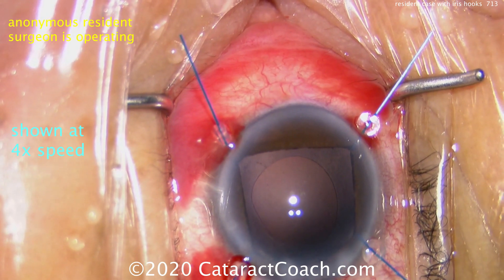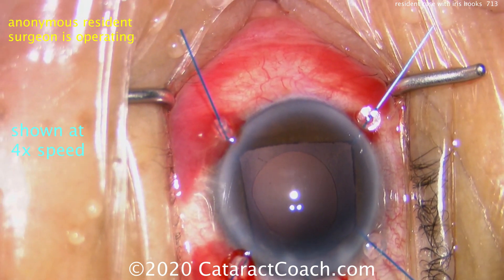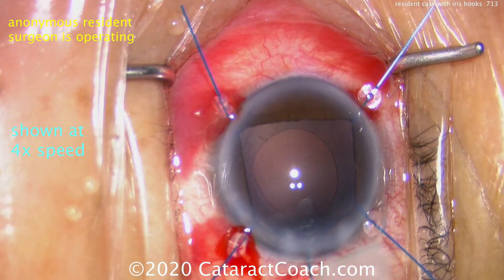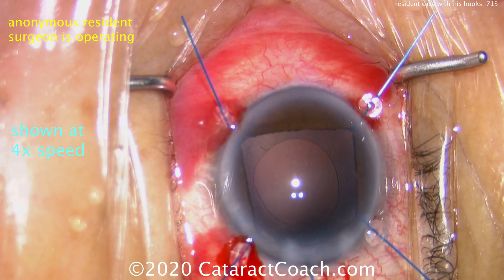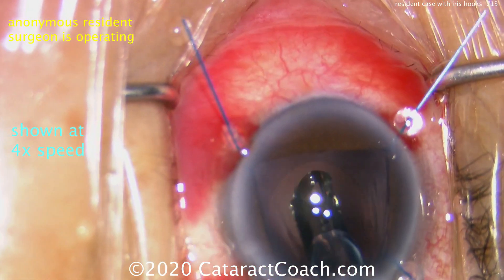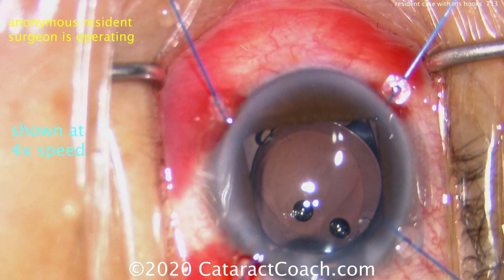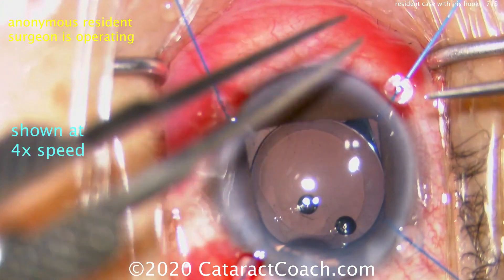With a good fill of viscoelastic, the IOL will be placed in the capsular bag. When is the best time to remove the hooks? You should keep them in for the lens insertion to make sure the IOL goes in the capsular bag. The best time to take them out is after the IOL is in the bag and before you remove viscoelastic, because now it's easy to remove.